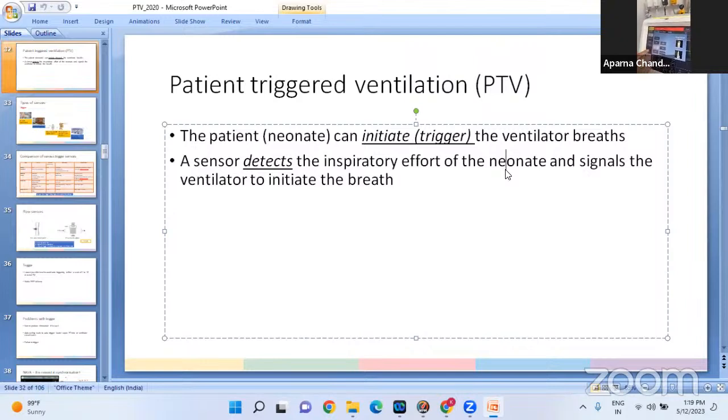So PTV is a broad term that refers to SIMV, PTV, and PSV. But in SLE, assist control is itself labeled as PTV. And pressure support ventilation, of course, is the flow-cycled mode of ventilation. This also we'll discuss in the subsequent class. Of course, we have the HFO mode that is available in the SLE ventilator. Let's just take SIMV for the sake of understanding the different knobs.